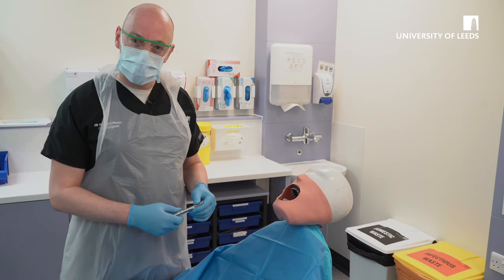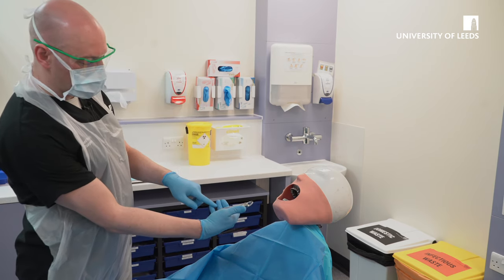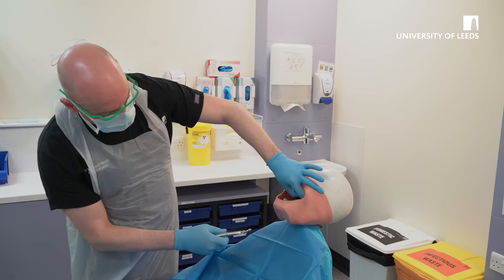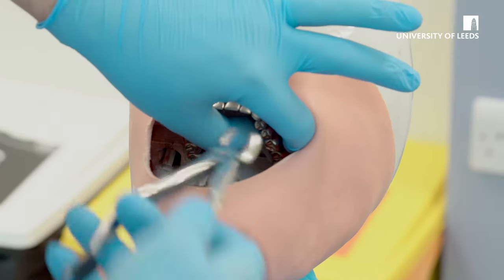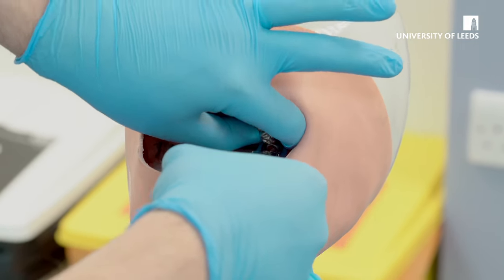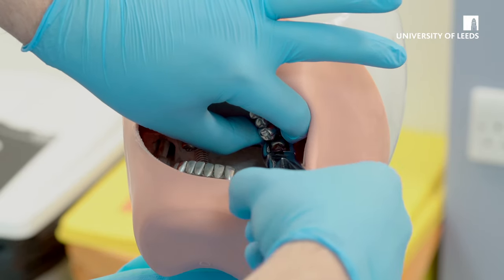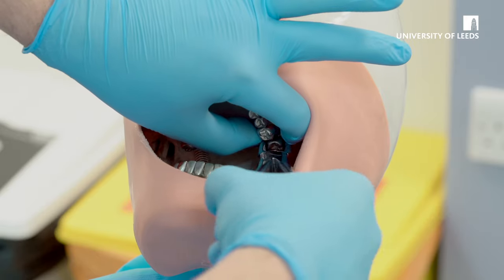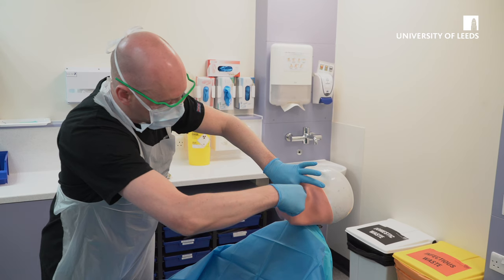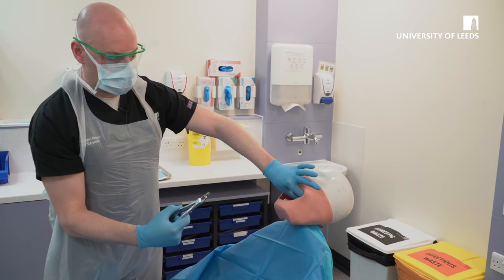This video will demonstrate the extraction of the upper left molars. Again, as a right-handed operator, the curvature of the forceps is to my fingers and the beak goes to the cheek, so it's buccal. With your non-dominant hand, support the alveolus and ensure the soft tissues are out of the way. Drive the forceps apically up the molar tooth, ensuring that you have a good grip. Gentle buccal movement back to the midline, and extract the tooth as we did for the upper right. Check the apices once the tooth has been extracted, and squeeze the socket to ensure haemostasis.